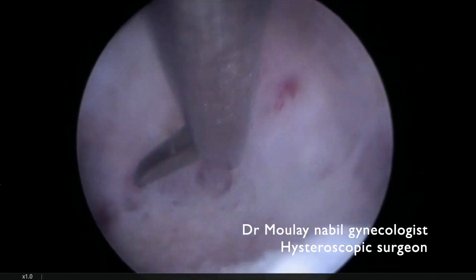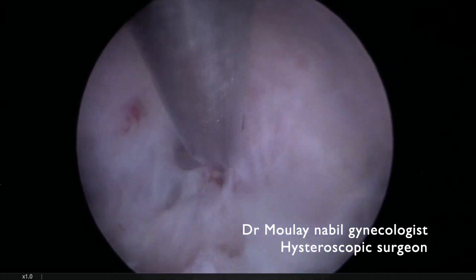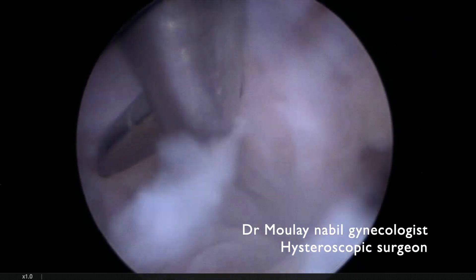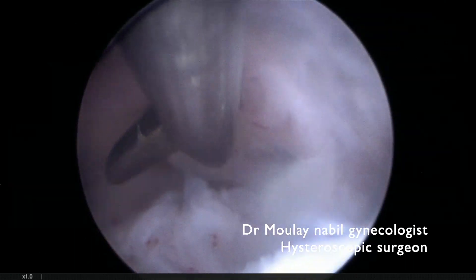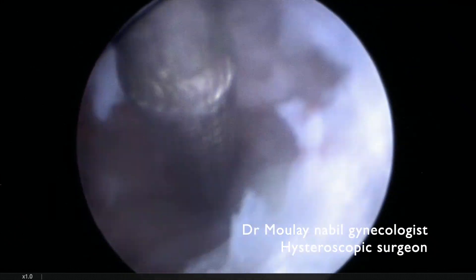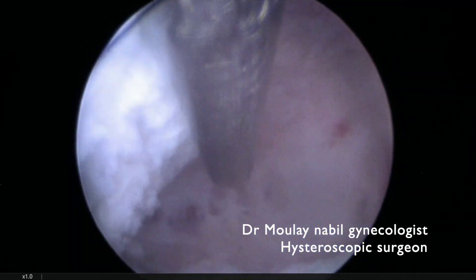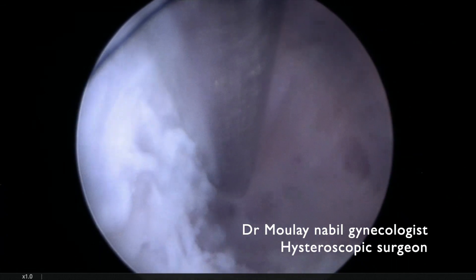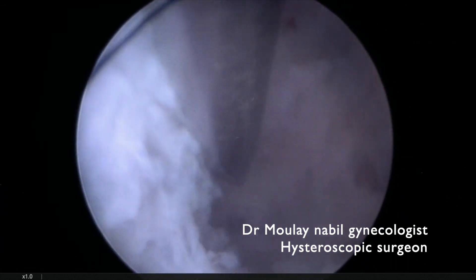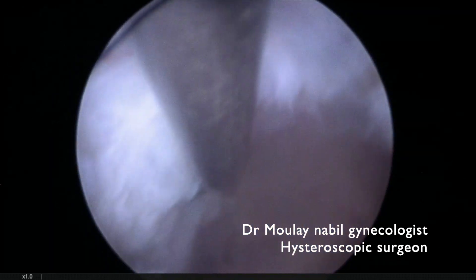In conclusion, when you perform a hysteroscopic treatment of severe Asherman syndrome: do not use energy, use as small an operative sheath as possible, use a cold scissor — never use energy, bipolar or monopolar — and perform a diagnostic hysteroscopy two months after the procedure to confirm the anatomical results.